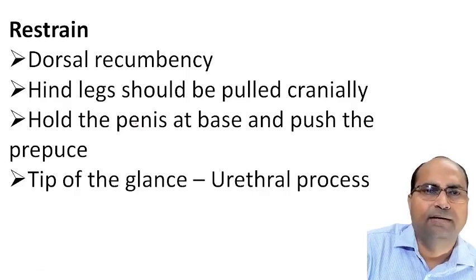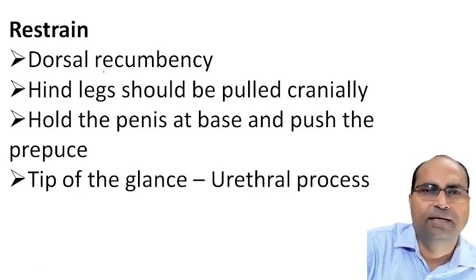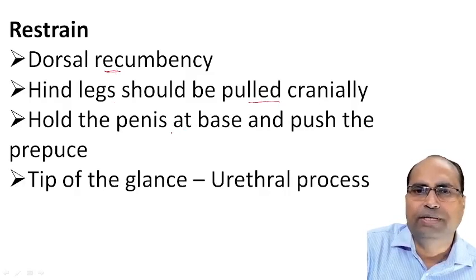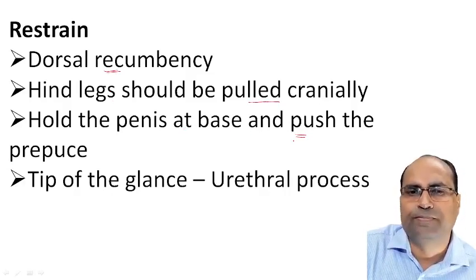After the lumbosacral epidural anesthesia, restrain the buck in dorsal recumbency. Hind legs should be pulled cranially, hold the penis at the base and push the prepuce.